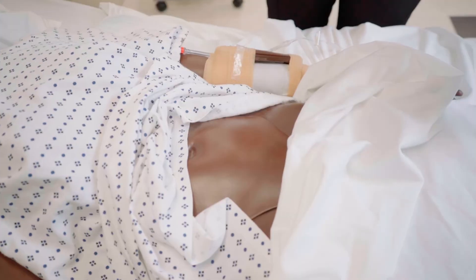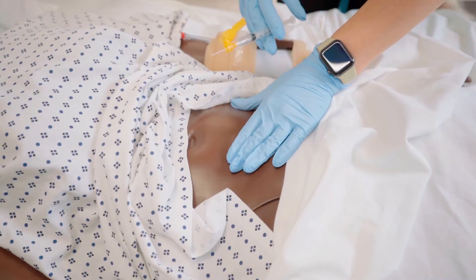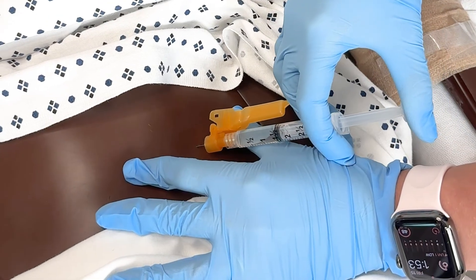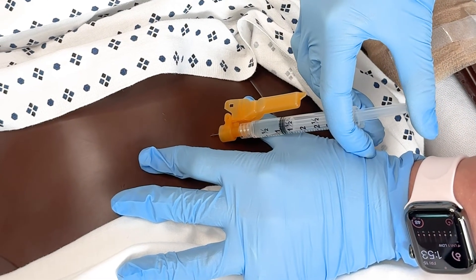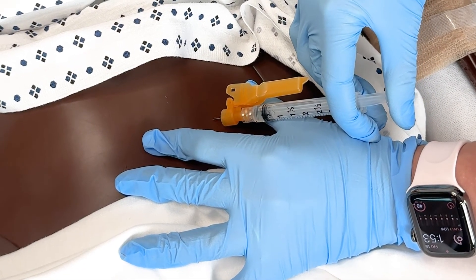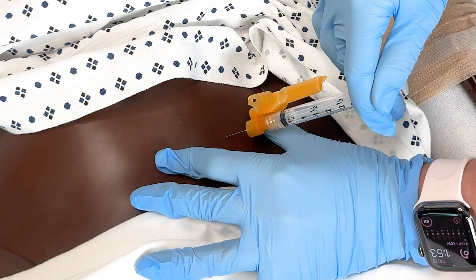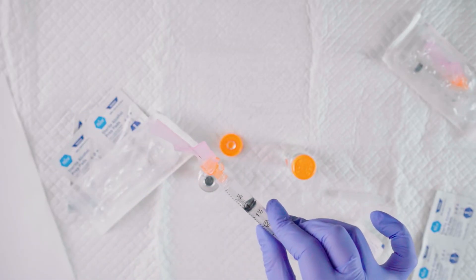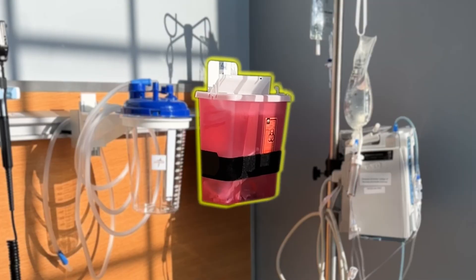Pinch the skin lightly with the gloves and place the needle at a 45 to 90 degree angle, then push the needle all the way into the skin. Inject the medication slowly until all the medication is injected. Remove the needle at the same angle it was put in and activate the safety feature of the needle. Then place the syringe in the sharps container.